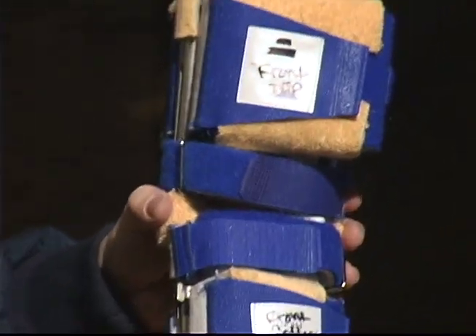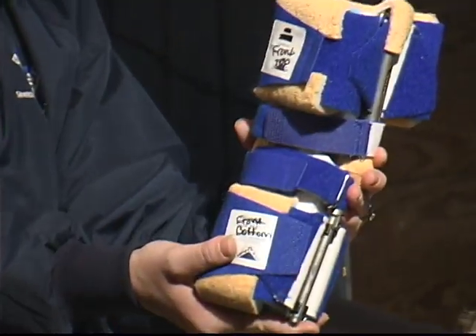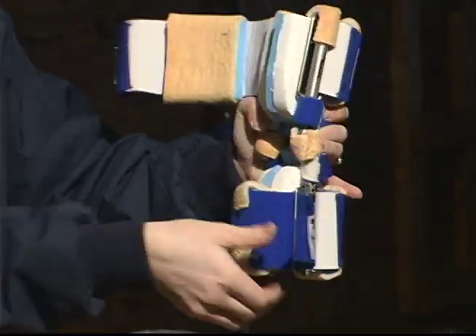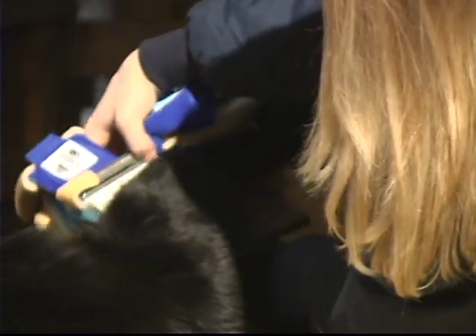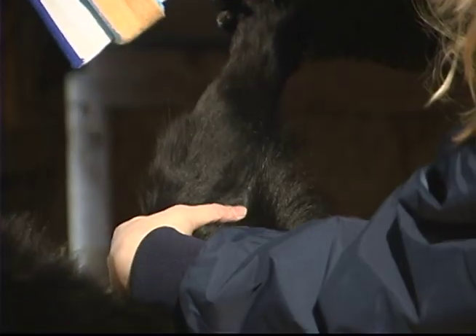Your Dynasplint consultant has labeled the cuffs front top, front bottom, back top, and back bottom. Follow these labels when applying the Dynasplint system to your animal. To apply the Dynasplint, open the back top and back bottom cuffs as well as the two counterforce straps. Bring the splint around the front of the leg, lining the cam up with the middle of the joint, while also making sure that the top wing pads are hugging either side of the leg above the joint.